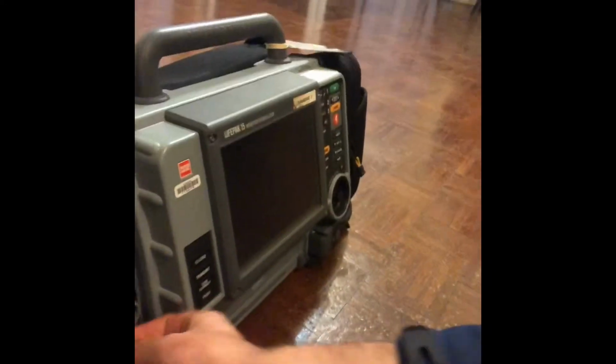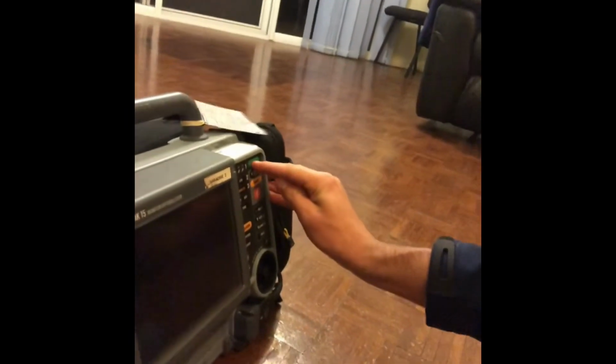All right, so now we're going to go through how to set up the circuit. First of all, we're going to connect the tube to the monitor. So we've got the tube down here, we'll connect it into the monitor in there somewhere. We'll turn it on. Next, we're going to attach the airway adapter to the breathing circuit.